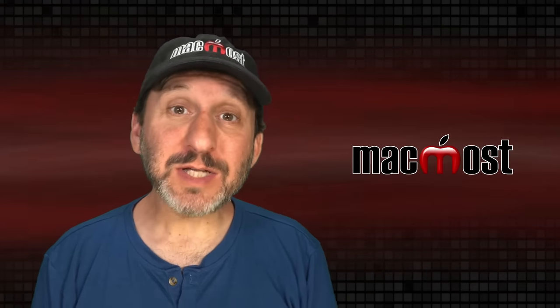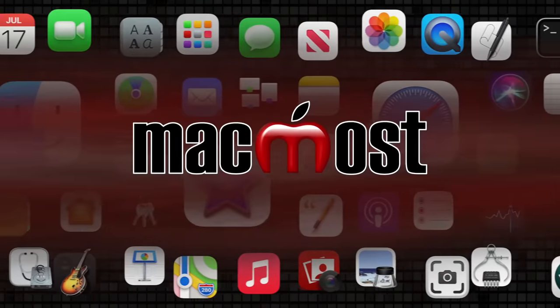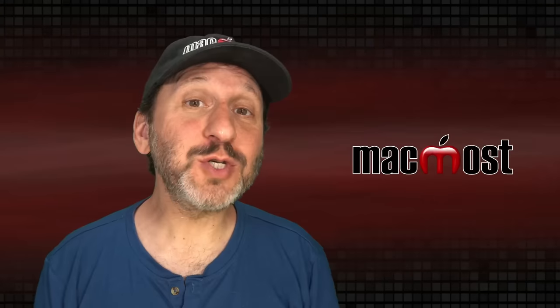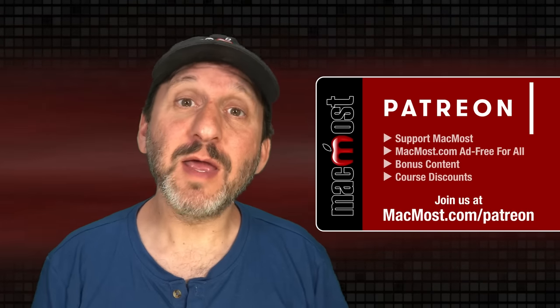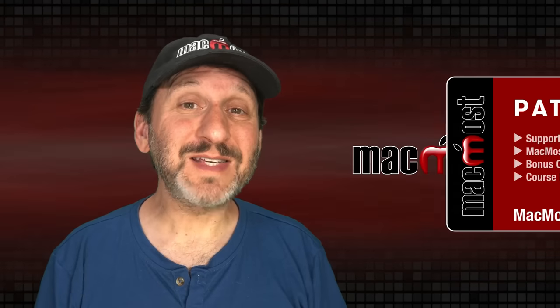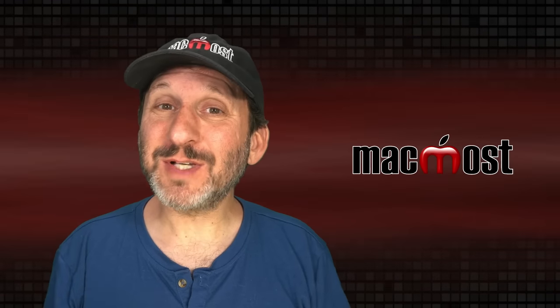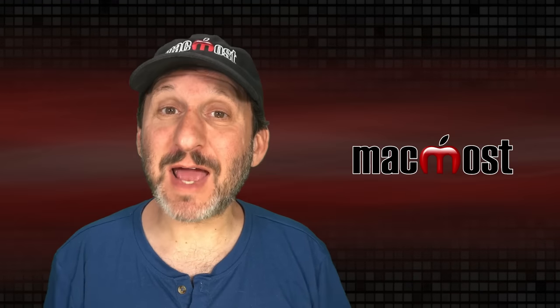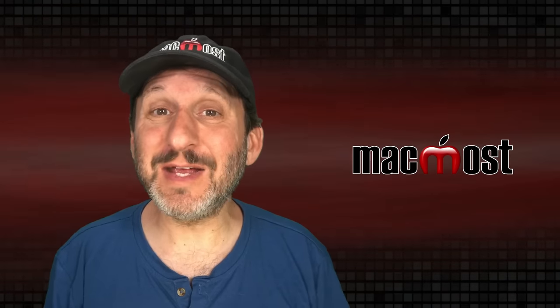Hi, this is Gary with MacMost.com. Let's take a look at using Live Listen on your iPhone. Live Listen allows you to use your iPhone and your AirPods or some Beats headphones, and it works kind of like a hearing aid. The microphone on your iPhone will be used to capture sound in the environment around you and then amplified to your AirPods so you can hear better.